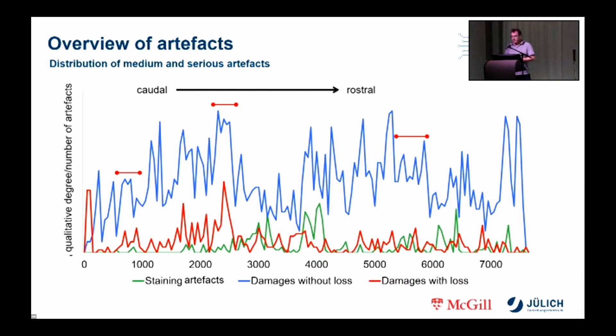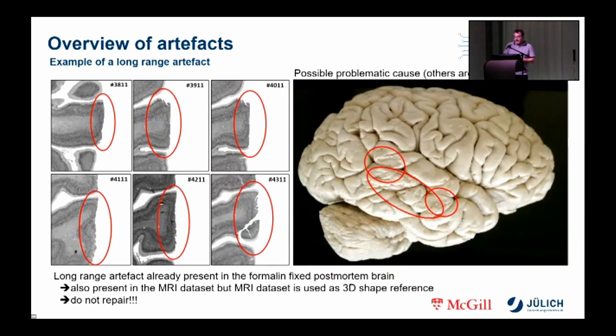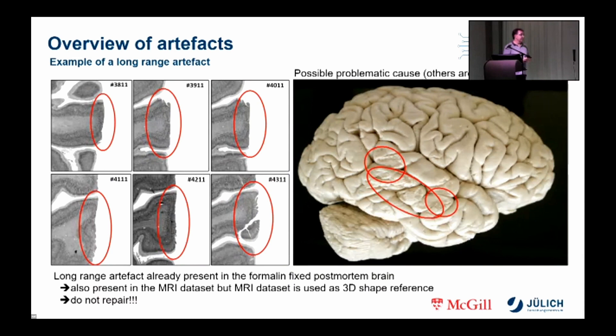Not all artifacts need to be repaired. For example, some artifacts were created by removing the brain from the skull — as seen in the photo taken before the MRI scan, these artifacts were already present and are therefore also in the MR dataset. Since this MR dataset is used as a shape reference for the 3D reconstruction, artifacts that were already present before the MR acquisition must not be repaired.